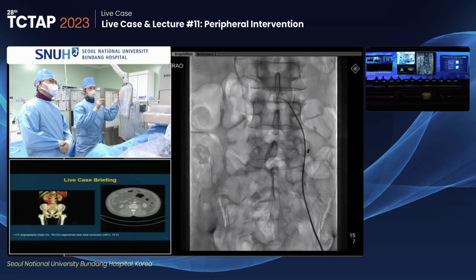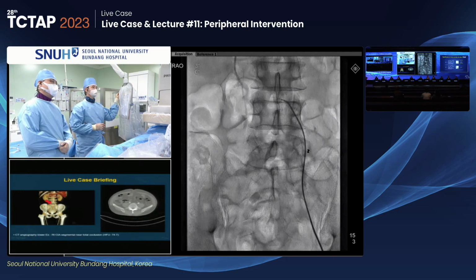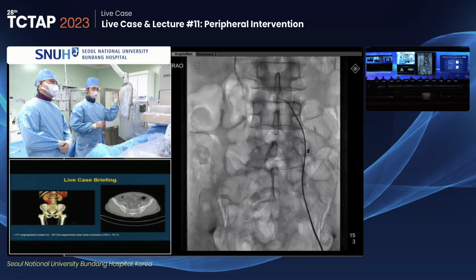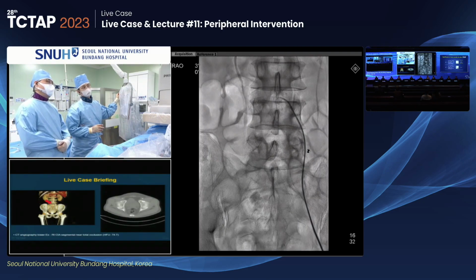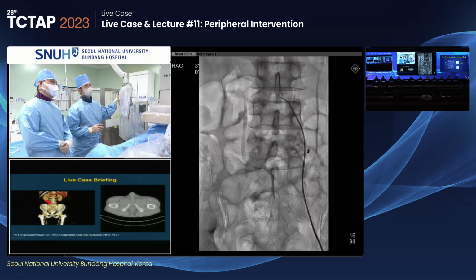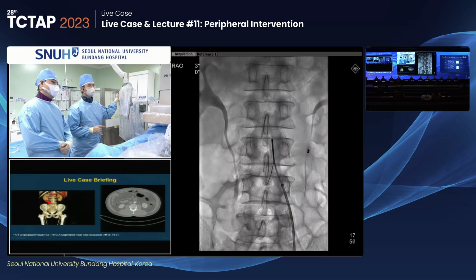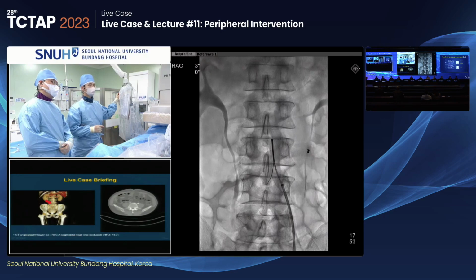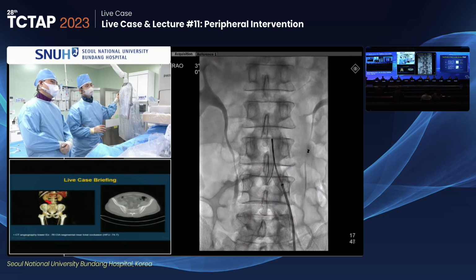I just touched the proximal region to feel how thick it is, and this 035 wire cannot pass freely. If there is some thrombus, this wire can easily pass the region, and then the situation is totally changed to a thrombotic region.